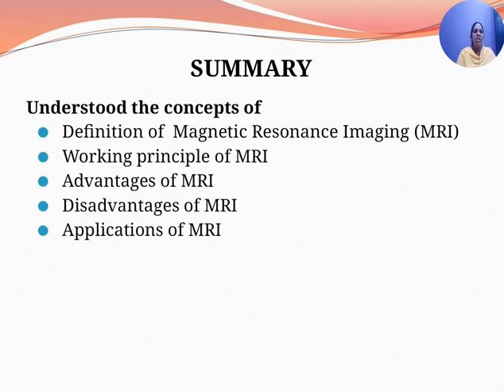So the advantages of MRI are better soft tissue contrast resolution. Imaging slices can be obtained in multiplanar, sagittal, coronal and oblique directions. There is a total absence of harmful radiations like X-rays, and hence it is a non-invasive imaging technique. No ionizing radiation, variable thickness in any plane, many details without IV contrast.